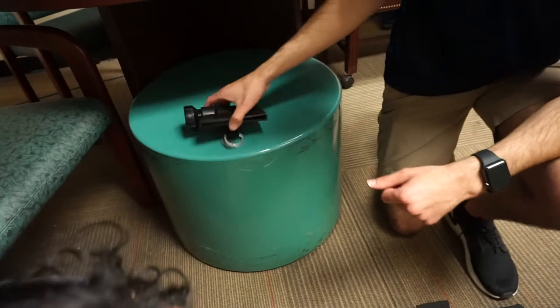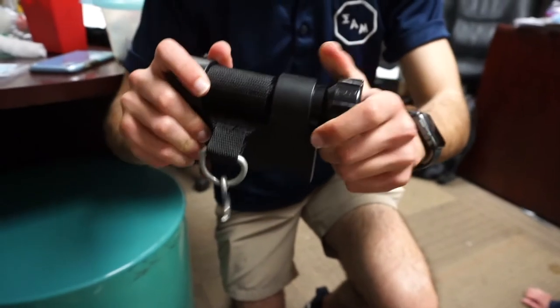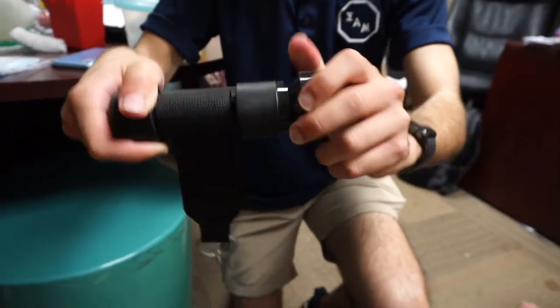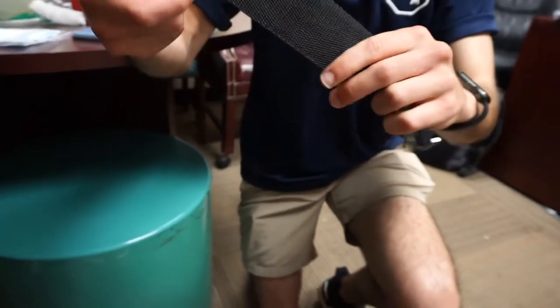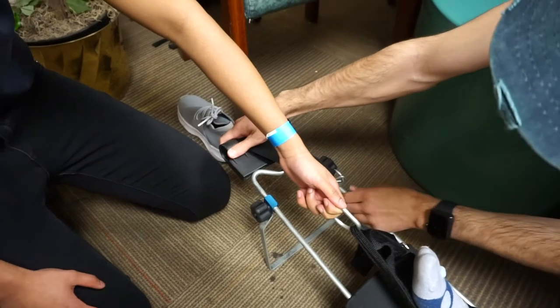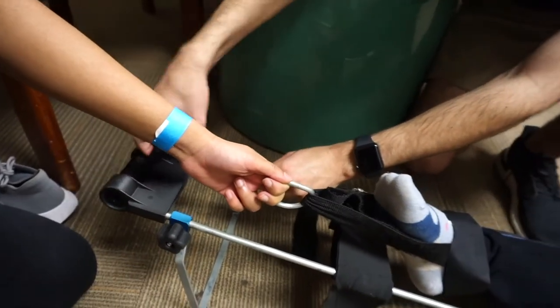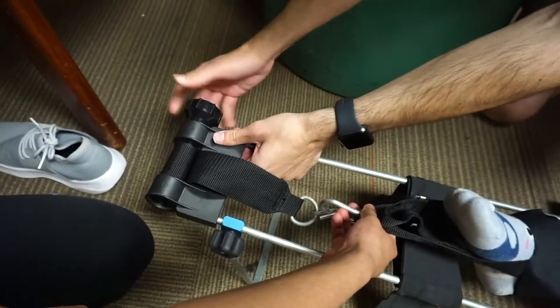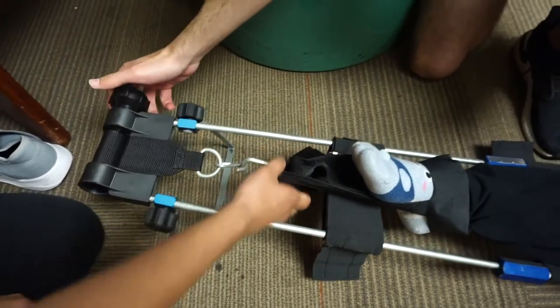Marshall, go ahead and take the winch and talk through how to undo it. If you try to just twist it, that's not going to work. What you want to do is pull it out, then you can loosen it. It only twists one way typically. Give some slack to this S-hook, then slide it onto the end of the hare traction splint. Apply the S-hook to the D-ring, then tighten the winch until the force meets the amount of traction that Diane's been holding this entire time. Diane continues to hold manual traction throughout.